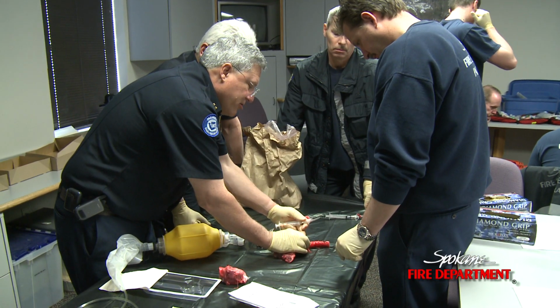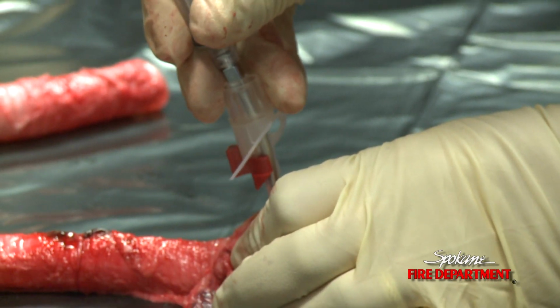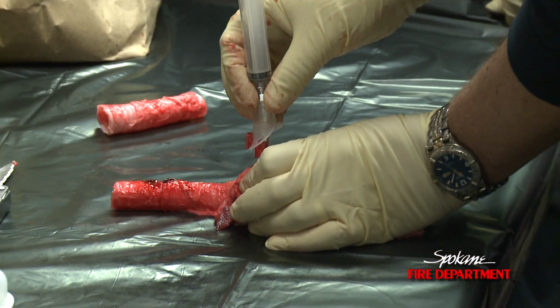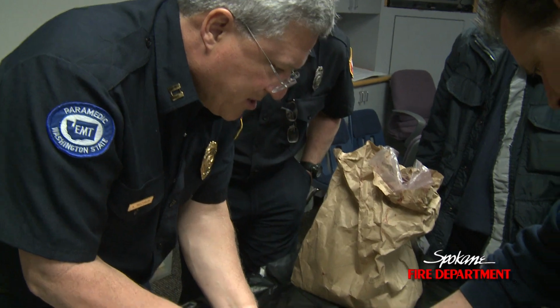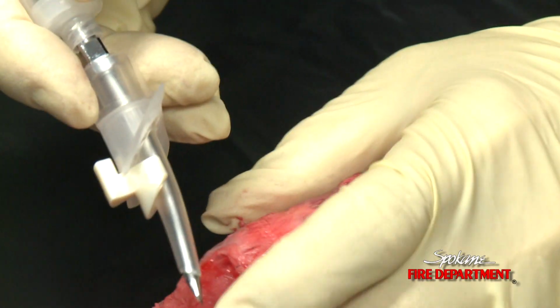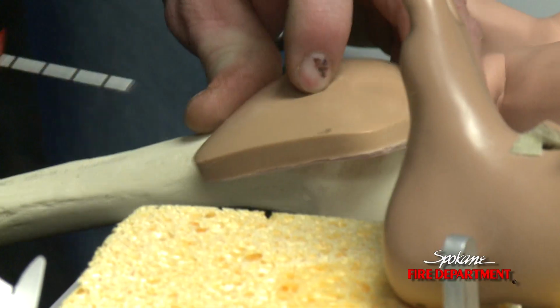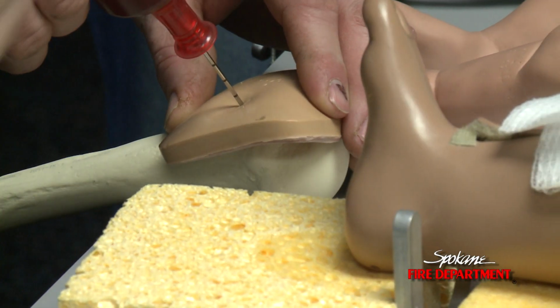Some other things we're doing here today are less common procedures, less likely to be necessary. One of them is doing this quick trach on the pig tracheas over here. Humans are a lot like pigs and vice versa, and so the pig trachea is a nice model for us to use. So we got a bunch of pig tracheas, and the guys are practicing sticking the rescue airway into the trachea. This is something that we use on occasion when we can't get a person intubated and get air into them for any other reason, or maybe they've got an upper airway obstruction or something of that nature.